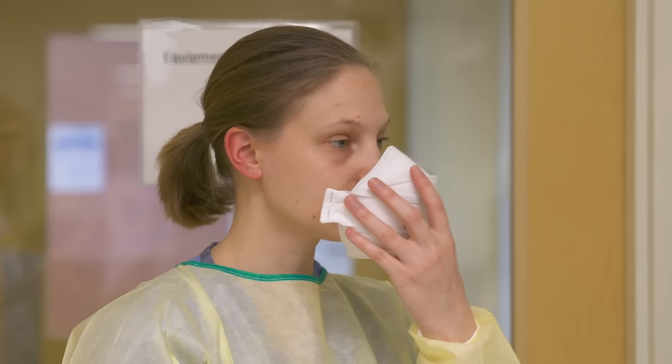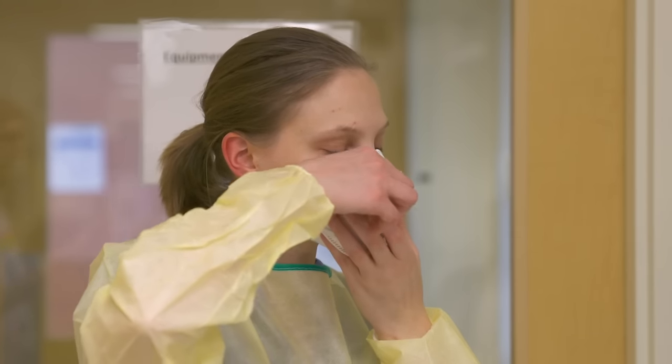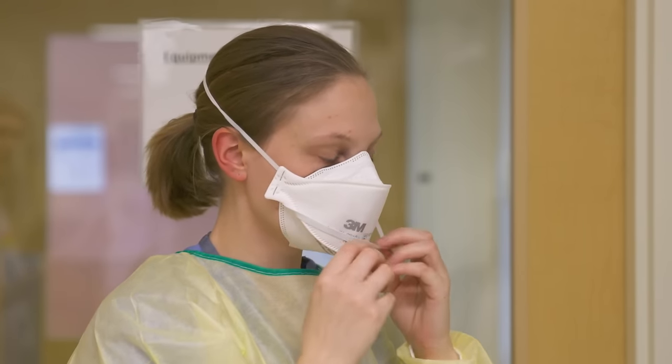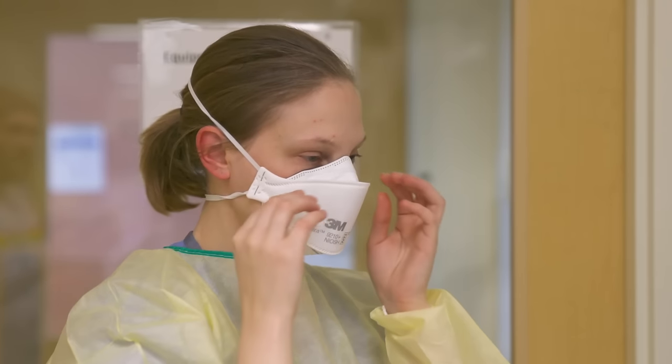Place your fit-tested N95 mask over your nose and under your chin. Place the top strap at the crown of your head. Stretch the bottom strap over your head to the back of your neck. Mould the nose strip to ensure a secure fit and tight seal.